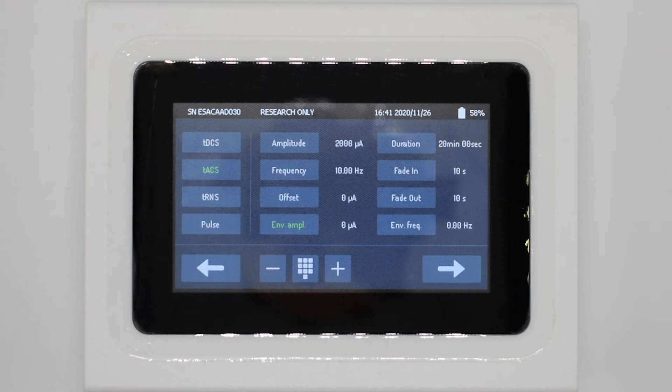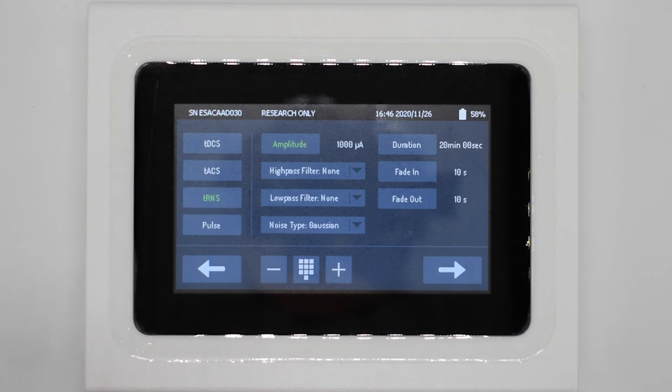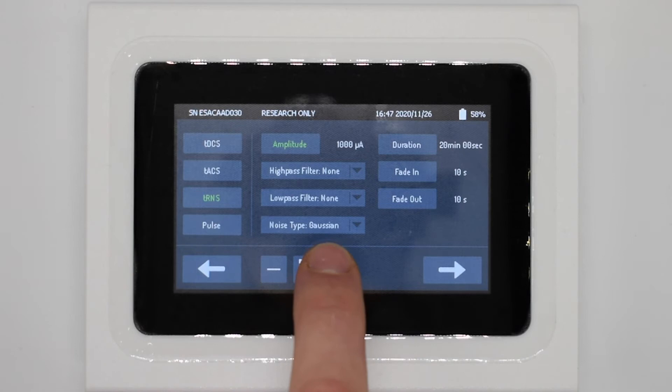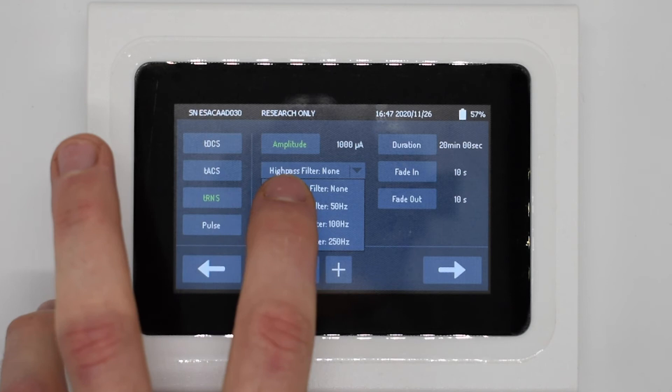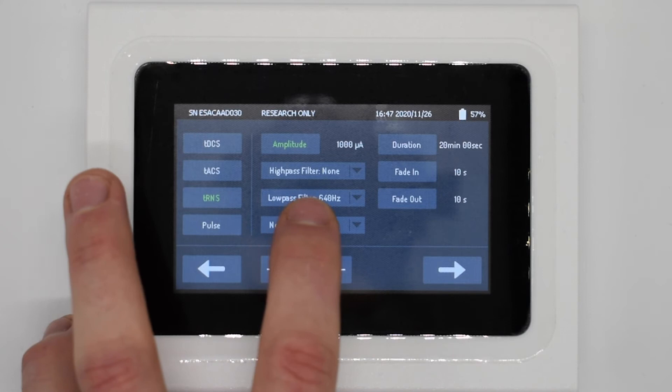Underneath TACS we then have TRNS, which stands for transcranial random noise stimulation. As well as amplitude, which can be changed with the up and down arrows, we also have two options for filtering and noise type. The high-pass filter and low-pass filter will filter out different frequencies of signal, and the noise type lets us change between Gaussian and rectangular noise.